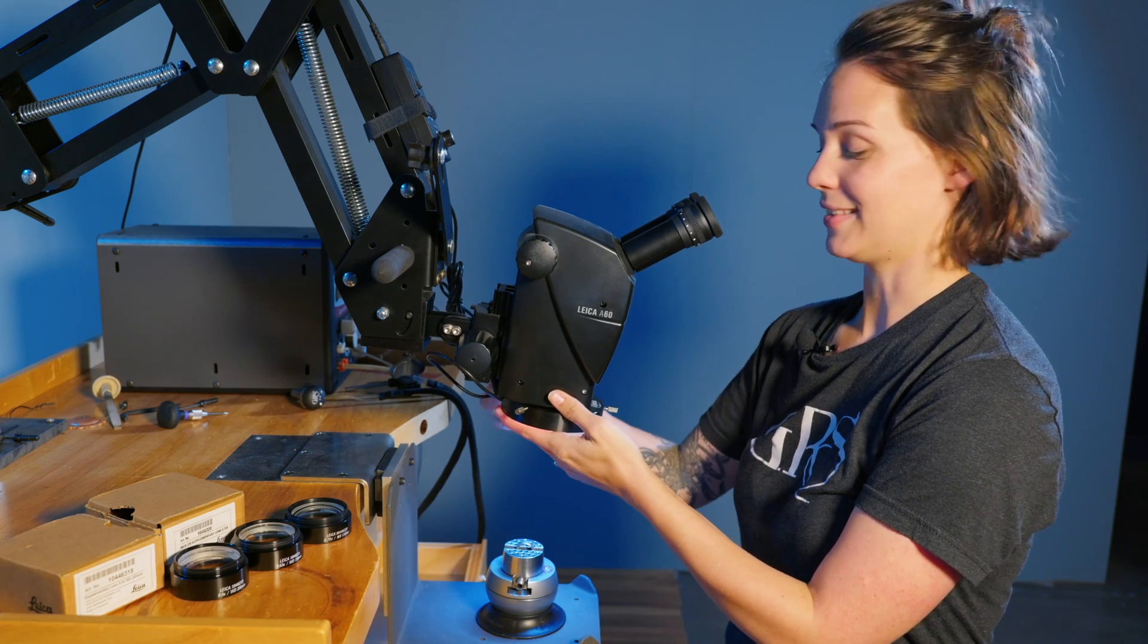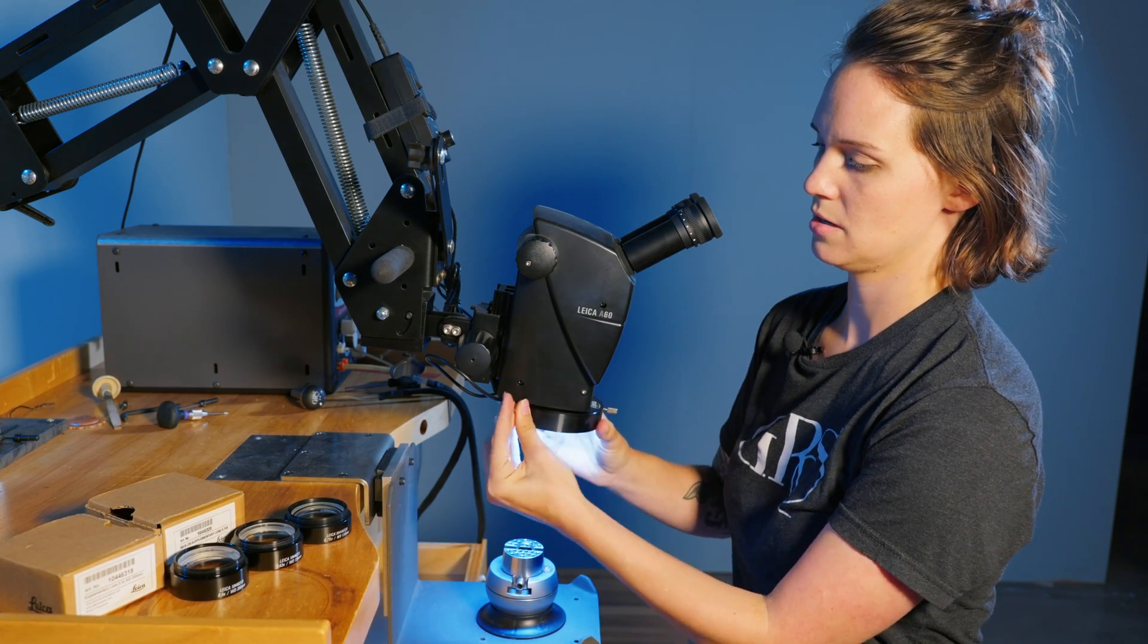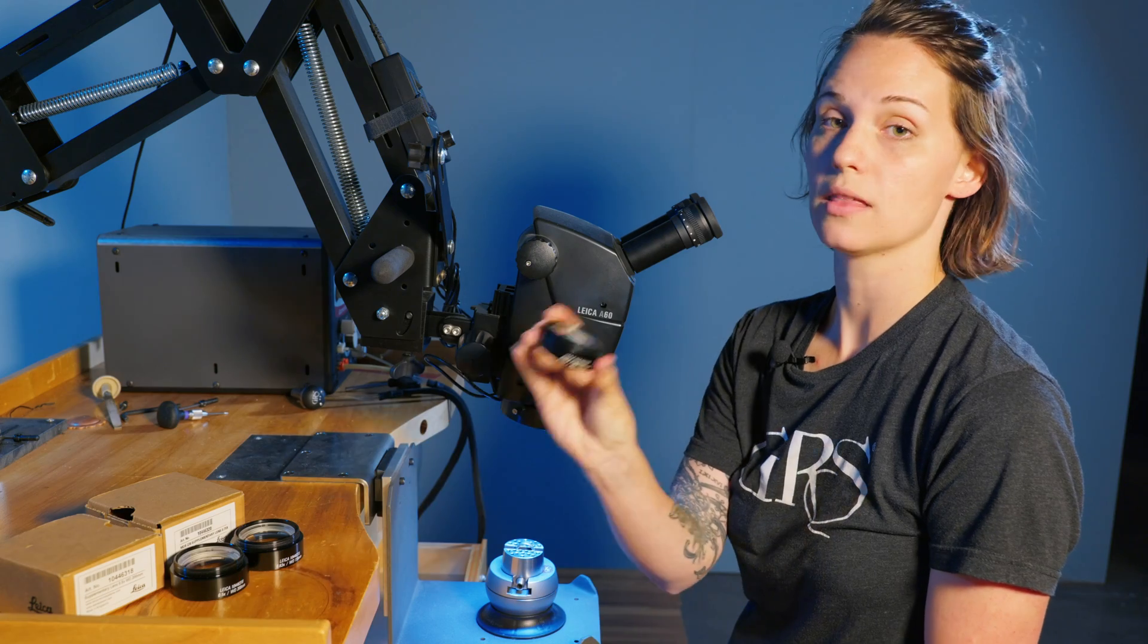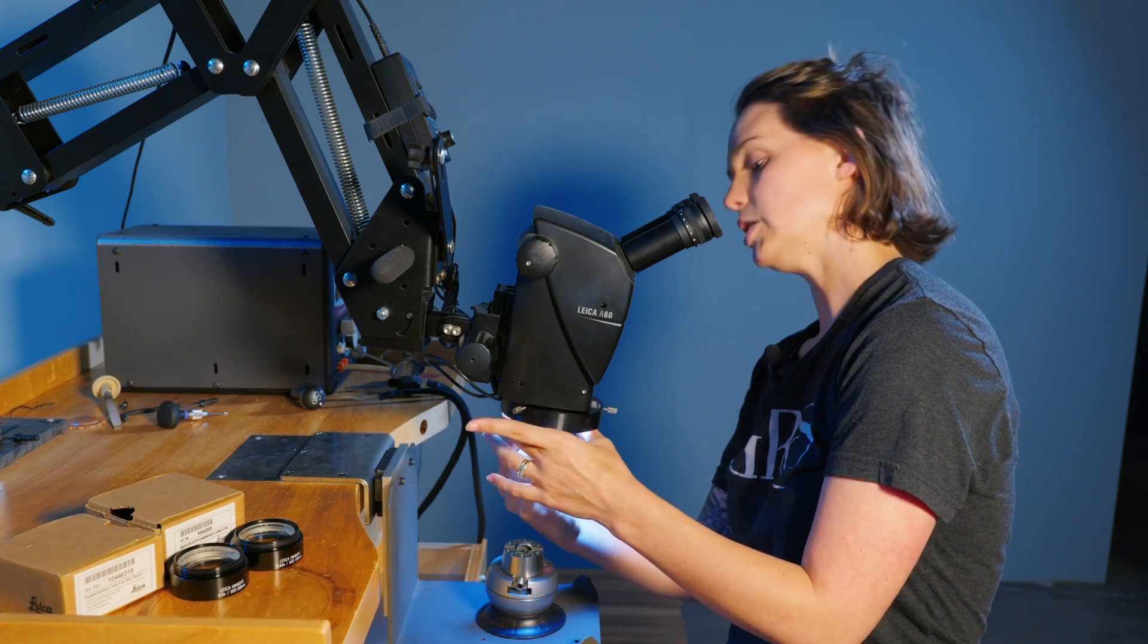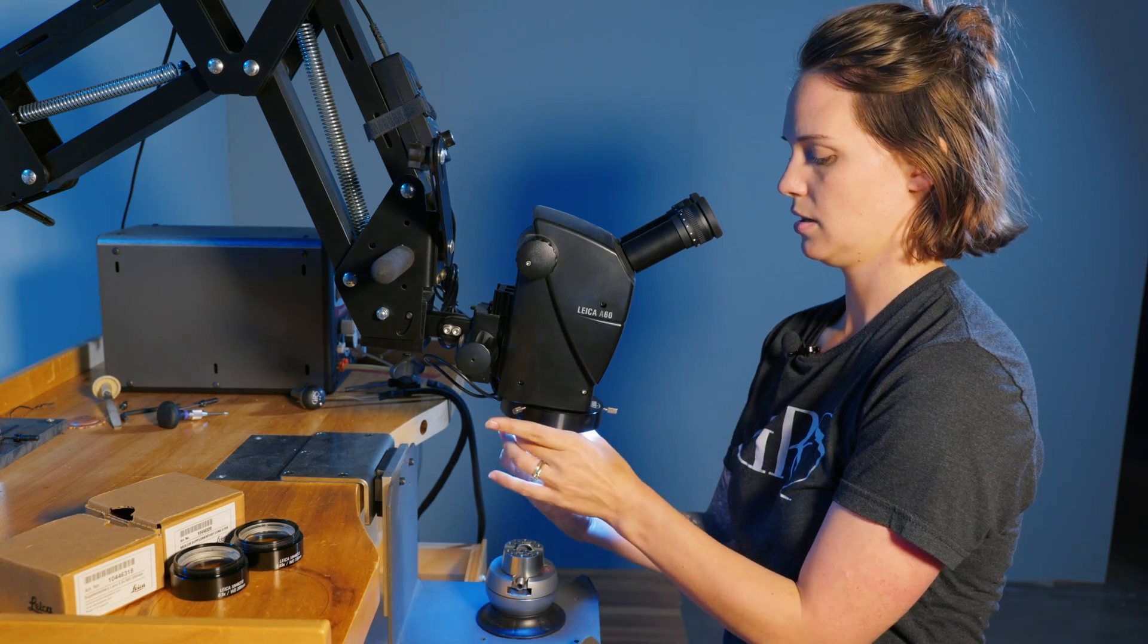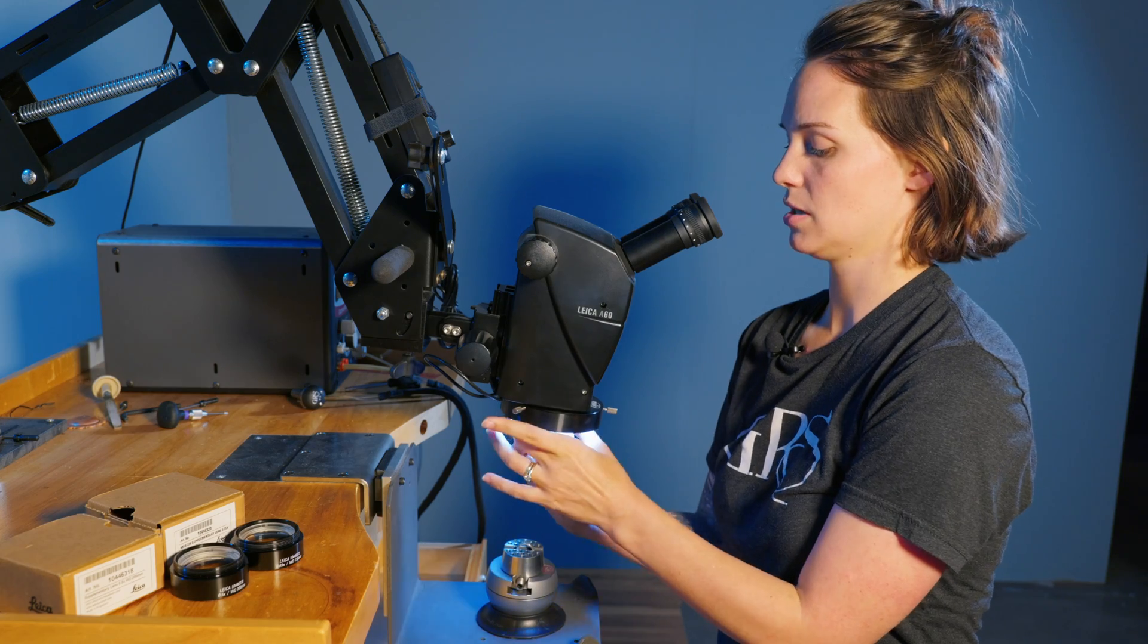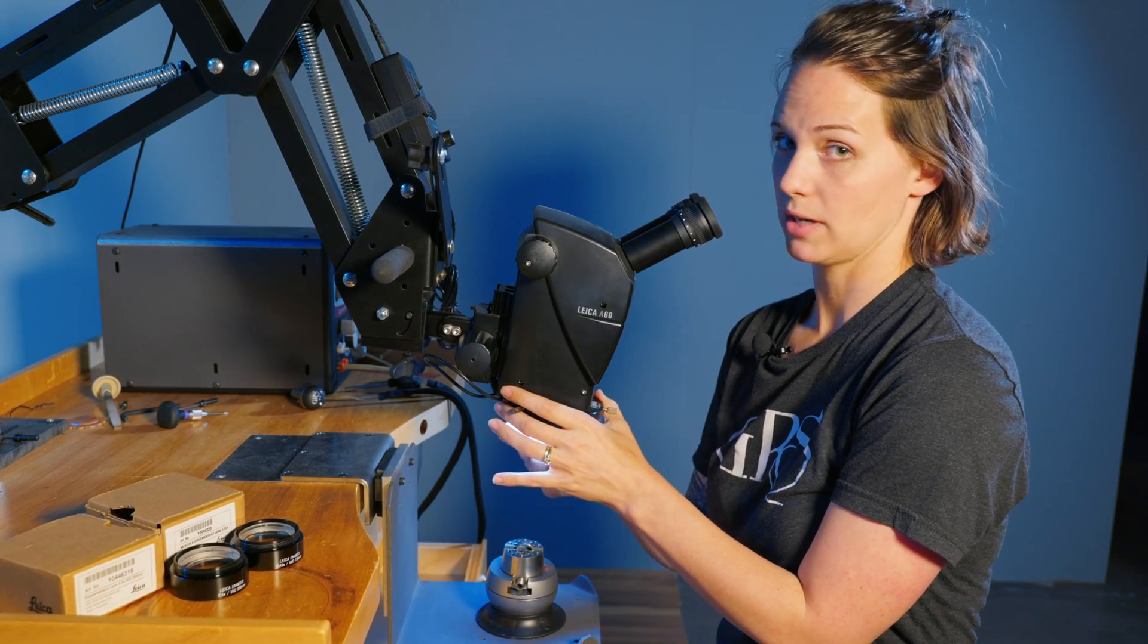Once you put that on there, we can attach our auxiliary lens. We're going to start with the 0.75. This one is going to have the smallest working distance but it's also going to have the most power or the highest magnification.